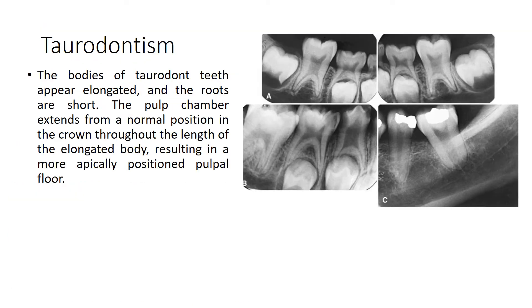Taurodontism: the bodies of taurodont teeth appear elongated and the roots are short. The pulp chamber extends from its normal position in the crown throughout the length of the elongated body, resulting in a more apically positioned pulpal floor. This looks like a bull's horns, hence the word taurodontism. You can see that the pulp chamber is very large and the roots are consequently shorter.